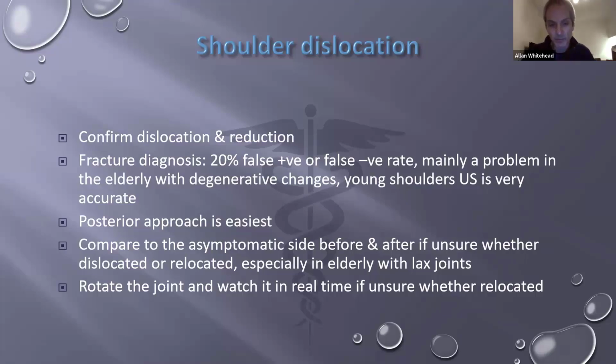From the point of care point of view, and also from the sonographer approach, we all generally agree that the posterior approach is the easiest to learn and master and the most widely used, therefore, because of that. And I think one of the main reasons is there's less structures there that you've got to identify, and particularly the coracoid process anteriorly just makes it a bit more complex. The posterior approach is a cleaner approach.